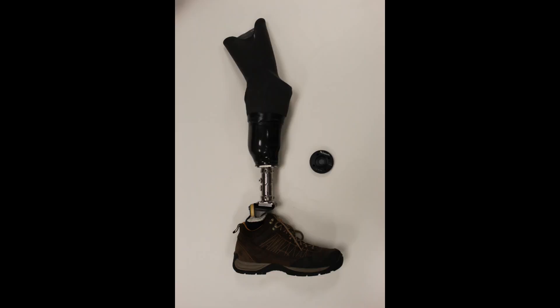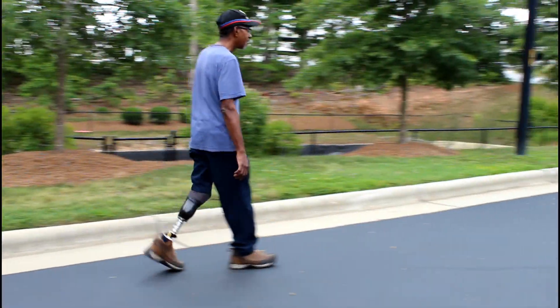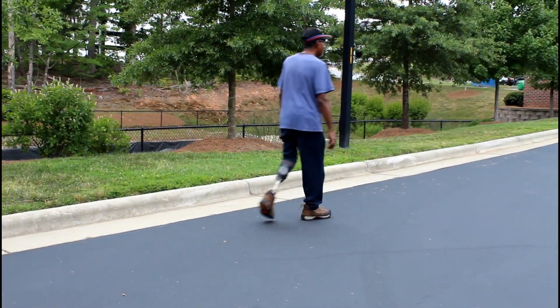It is worth noting that no prosthetic system is perfect and no single system works for everyone. With that said, for people who expect to be long-term active prosthetic users, suction is one of the best systems.